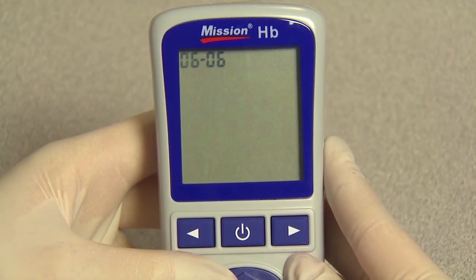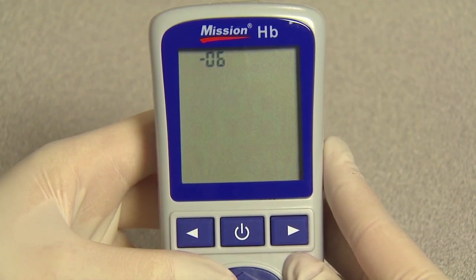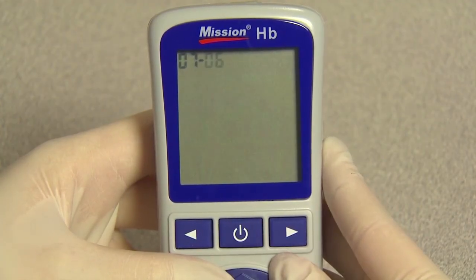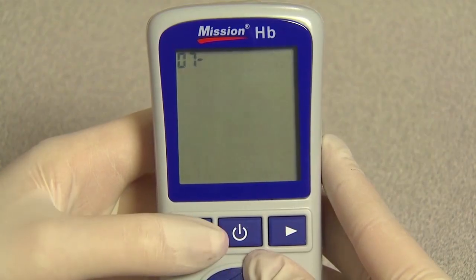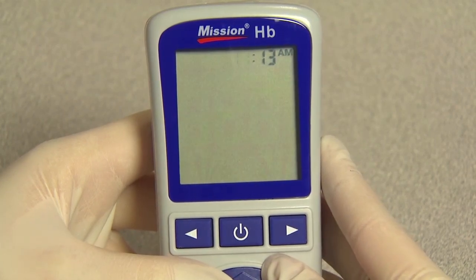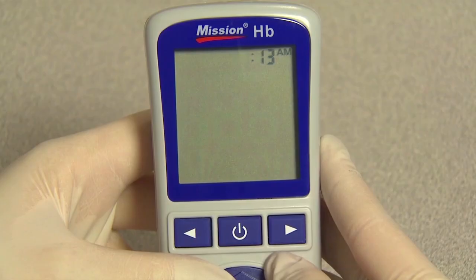The month and date will appear at the top of the display, separated by a single dash with the flashing month. Press right or left until the correct month is displayed, then press the power button to save. The day will flash. Press right or left until the correct day is displayed, then press the power button to save and proceed to time setup. The hour and minutes will appear at the top of the display, separated by a colon with a flashing hour.